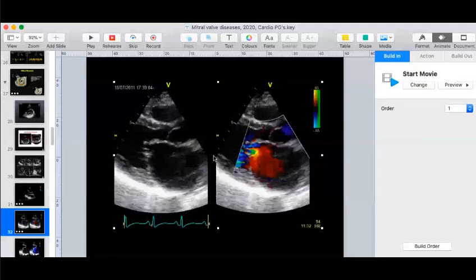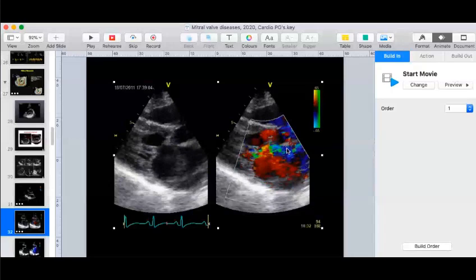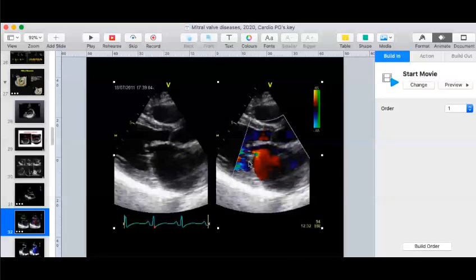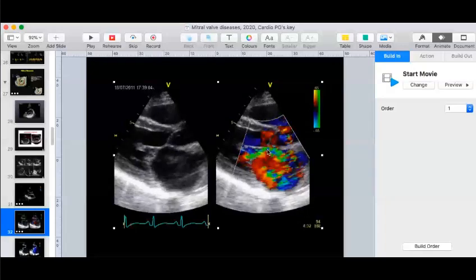But primarily, when you see a jet which is going anteriorly, this is a long axis. So this is the anterior aspect, and this is posterior, right? So in the long axis, when the jet goes like this anteriorly, the pathology usually is a problem in the posterior mitral leaflet. Are you okay with that? Anterior jet, it is the contralateral leaflet which is involved, that is the PML.